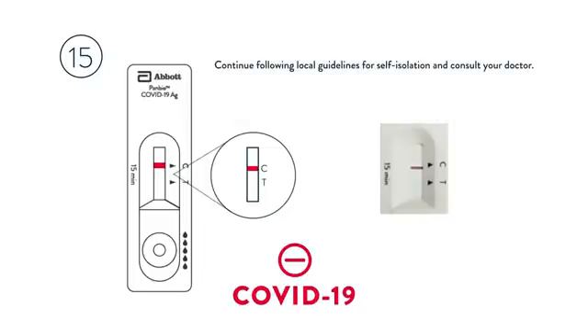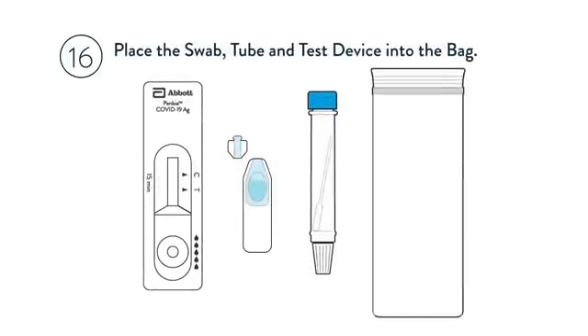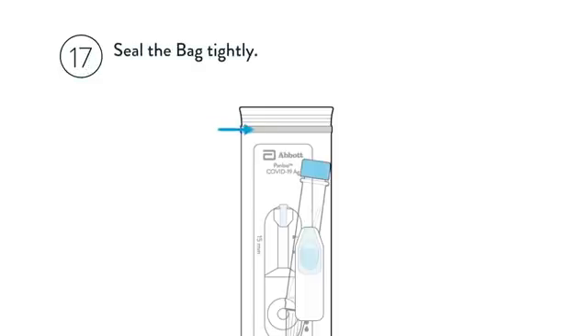Continue following local guidelines for self-isolation and consult your doctor. Place the swab, tube, and test device into the bag. Seal the bag tightly and throw it away in the waste bin.